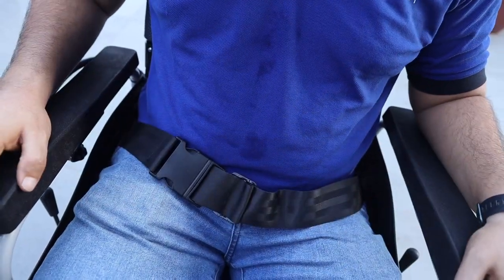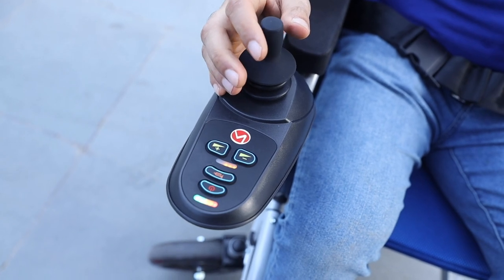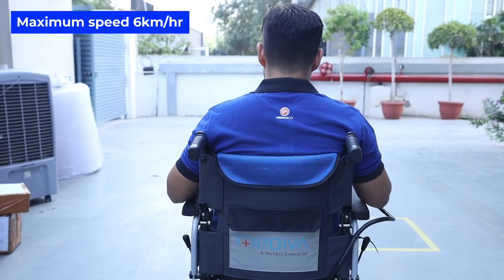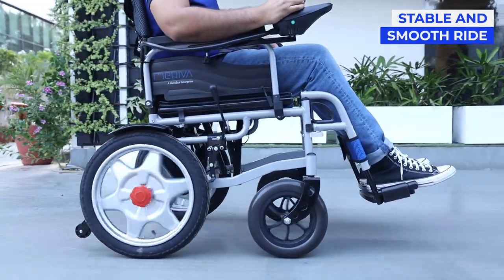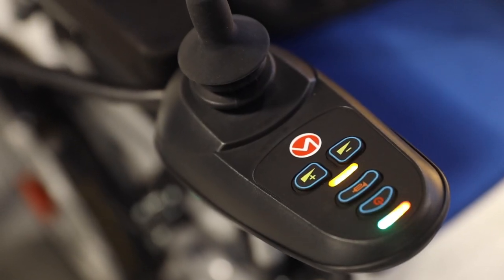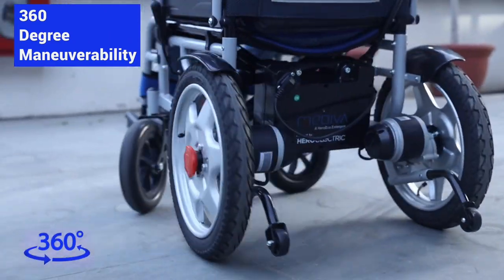Fix the safety belt, place your feet on the footrest, start operating the joystick and you are ready to ride. With a maximum speed of 6 km per hour, the Mediva Electric Wheelchair allows you unprecedented mobility. Its classic design enables a stable and smooth ride. The wheelchair is equipped with a feather touch 5-speed controller with 360 degrees turning capacity, offering great manoeuvrability.